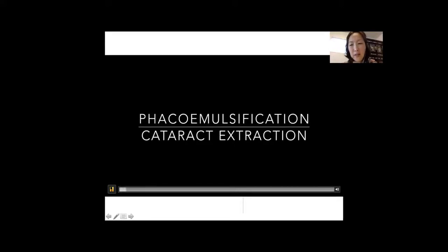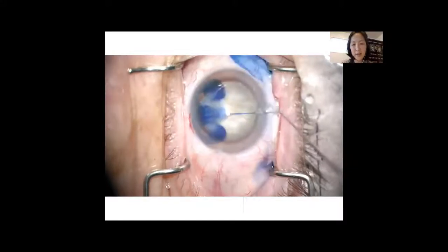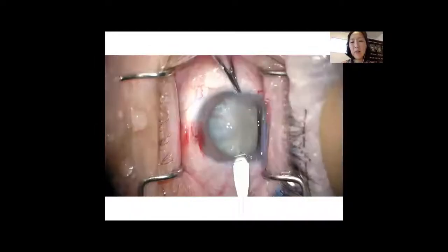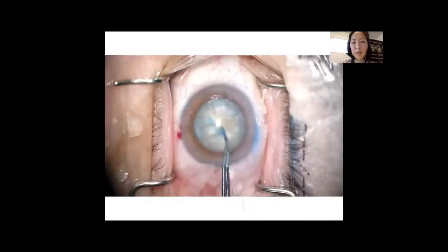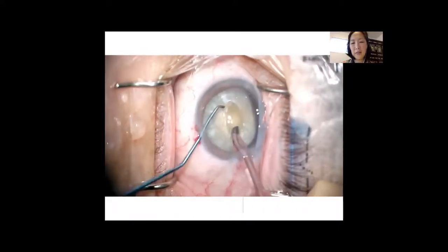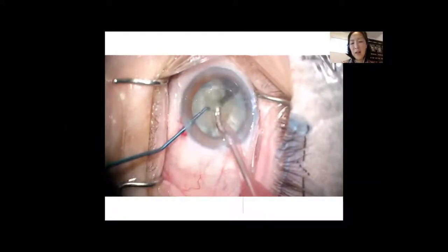I just wanted to start by showing video of a typical case in a patient that has a fairly significant lens. And this is the type of surgery that I'm doing traditionally. When there's not a lot of view, staining with trypan blue, doing a clear corneal incision, performing a continuous curvilinear capsulorhexis. And then this would be a traditional stop and chop case.